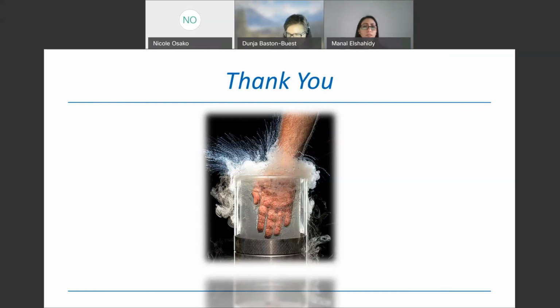I believe that tanks should be used according to what is recommended by the provider and by the insurance as well. But regarding the size, it doesn't matter. It can be 30 liter or 50 liter. It doesn't matter.